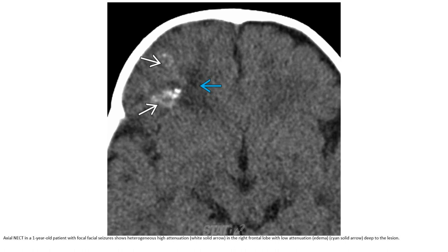Non-contrast CT in a one-year-old patient with acute seizure demonstrates heterogeneous high attenuation in the right frontal lobe with low attenuation deep to the lesion.